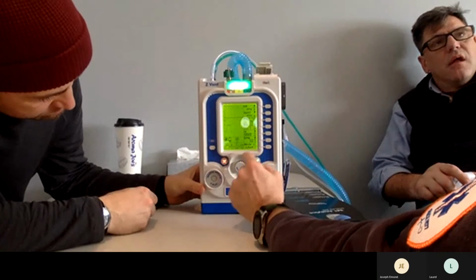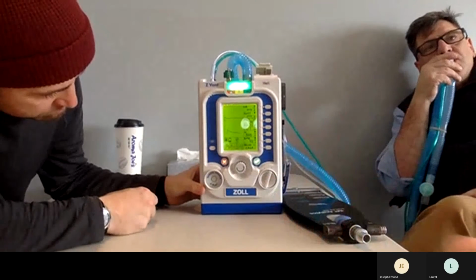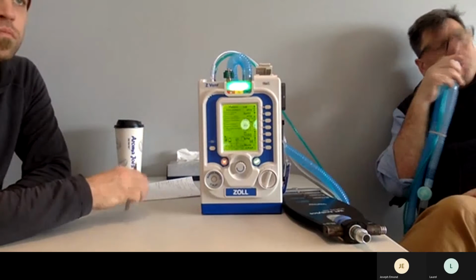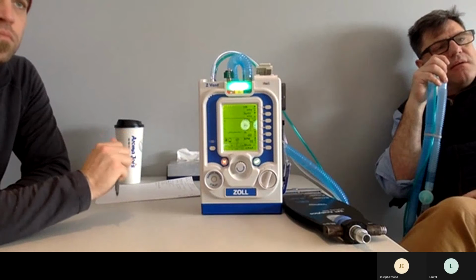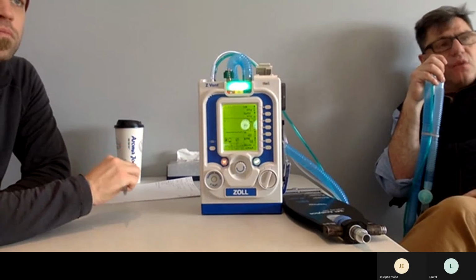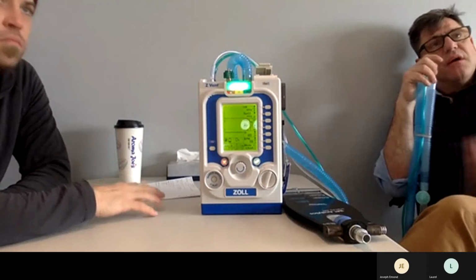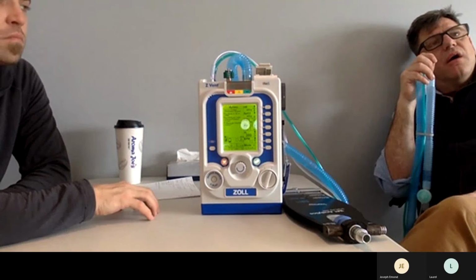I see the LC. Yeah, that leak control is on. It has better compensation for leaks associated with a mask than SimV would, which was made for tube. Although you can do some with leak compensation. So whether you're bi-level or CPAP, the leak control should be on.